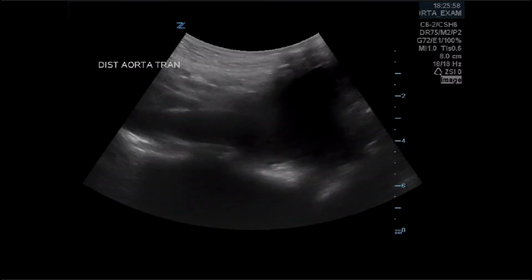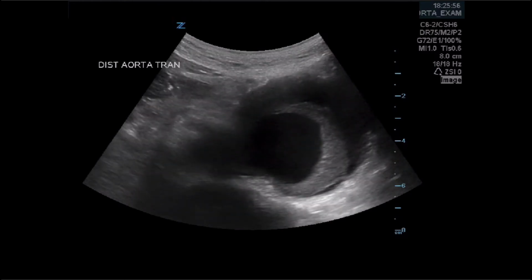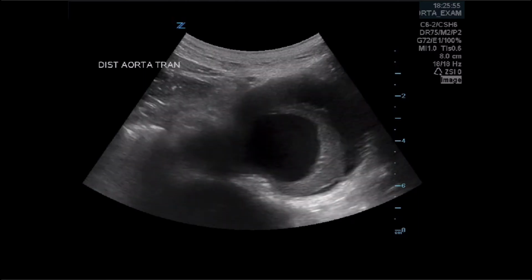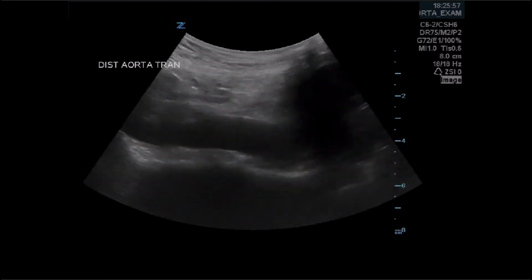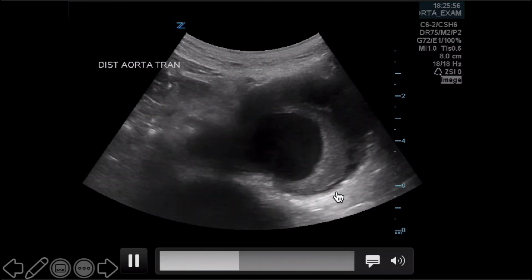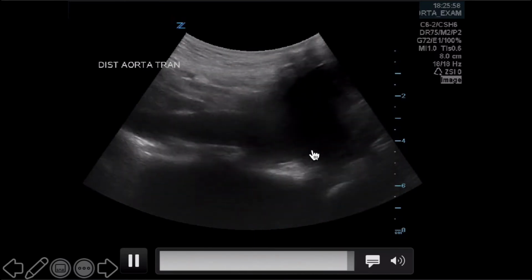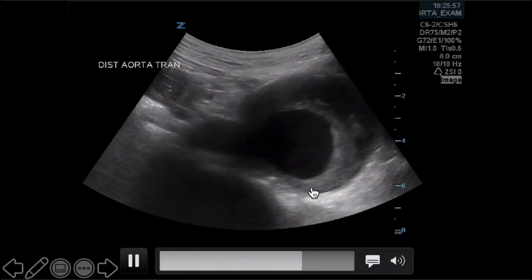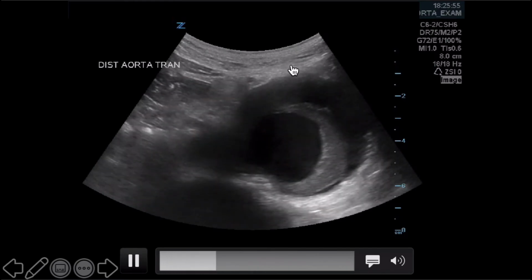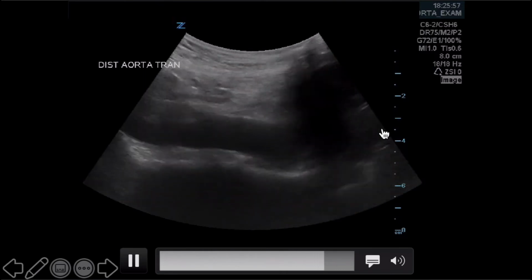While many of you have seen a normal aorta on ultrasound, finding an aneurysm is a little more rare. To help further the educational mission of these cases, I included a few clips from previous cases. Here we can see a large pulsatile structure with an echogenic clot within the aorta. The important concept here is that we need to make sure we measure the true size of the entire aorta, not just the internal lumen here. So if we were measuring the true size, we'd measure it from here to here and here to here.